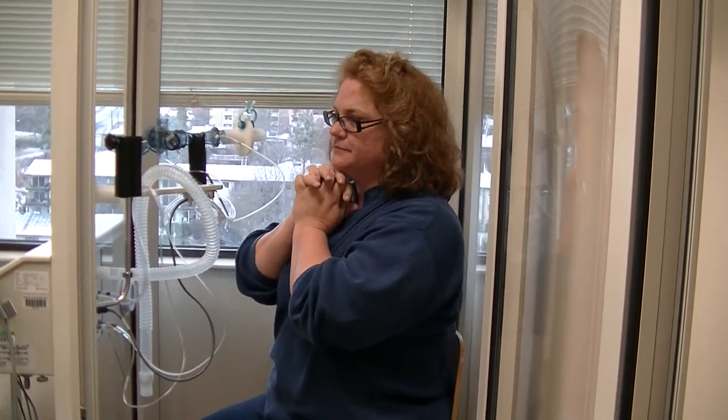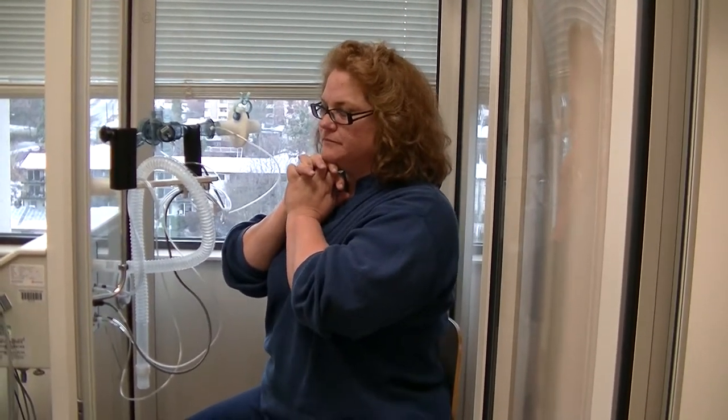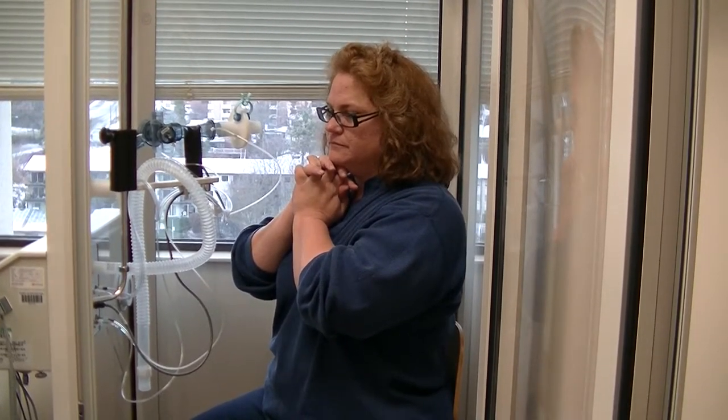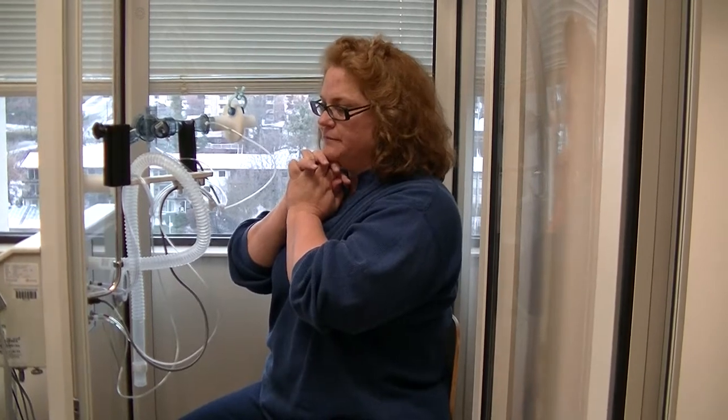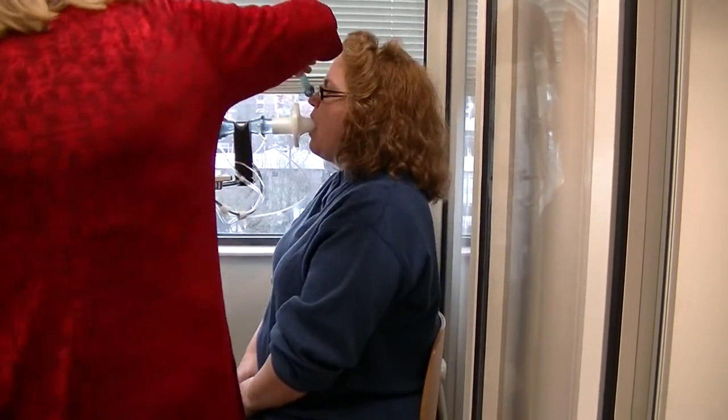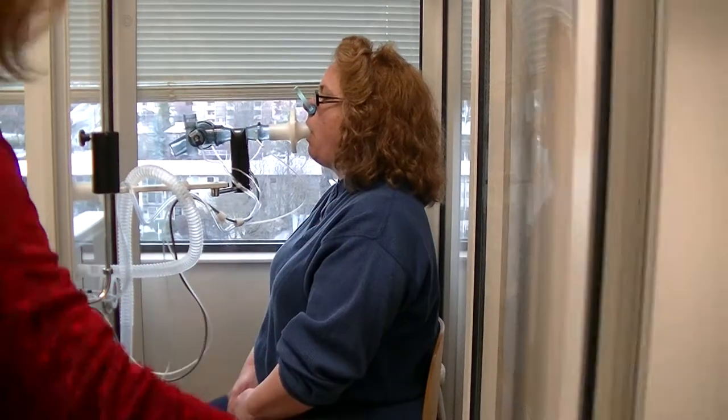Okay, just like that. Then the machine shuts off and I'm trying to get the pressure in your lungs. So for three breaths, you won't be able to breathe, but it's mostly just expiratory. Okay. I'm closing the door for this one.